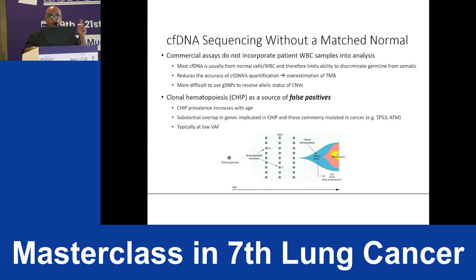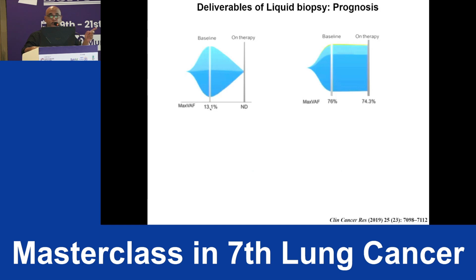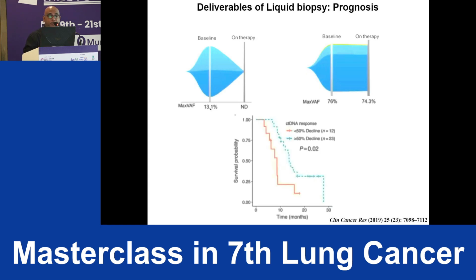Most likely, if you get these kinds of alterations, you would. The clinical aspect associated with the ctDNA fraction is that we know that at baseline, if the ctDNA fraction is higher, and on therapy, if there is a complete disappearance of the ctDNA fraction or if it's not, that has a strong clinical connotation, or survival probability, associated with it.